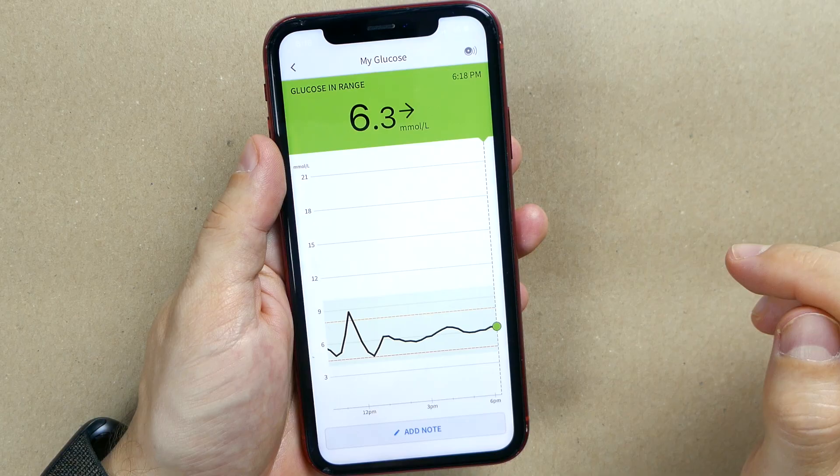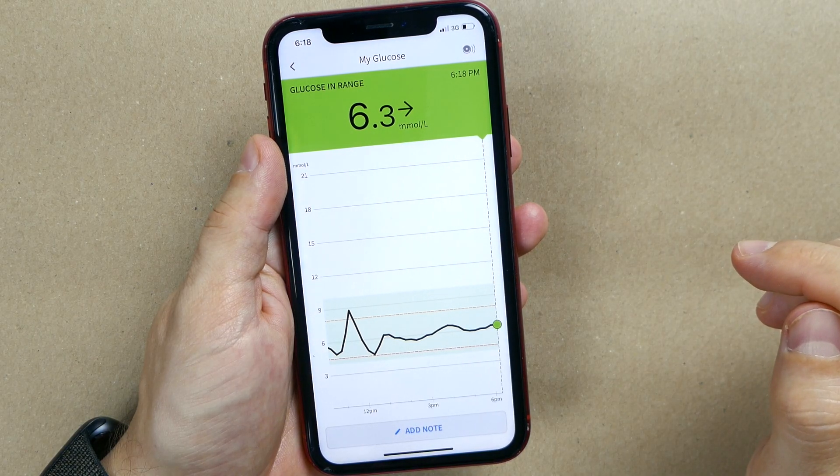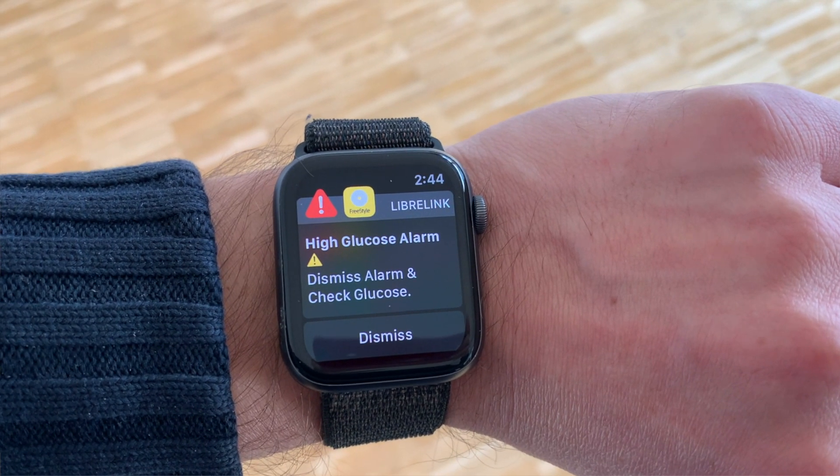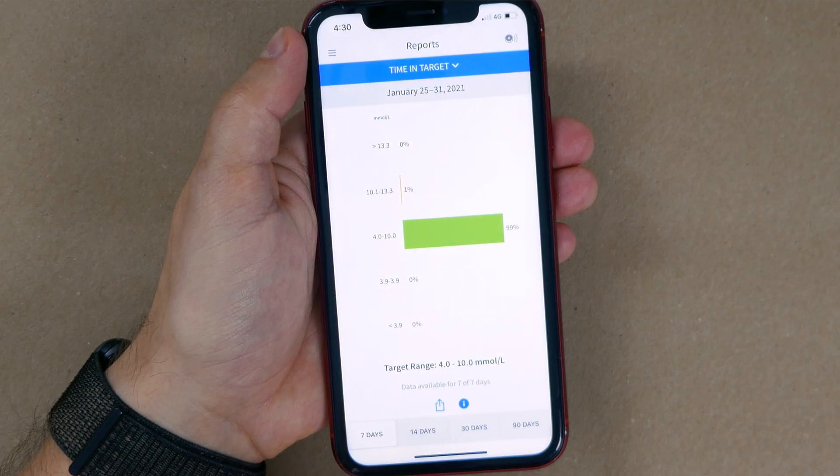In this video I'm going to show you how you get your Freestyle Libre readings on your phone and alarms on your watch without any third-party devices. I will share my favorite Freestyle Libre LibreLink app functions that help me stay in range for 99% of the time this week. Scan your sensors and let's go!